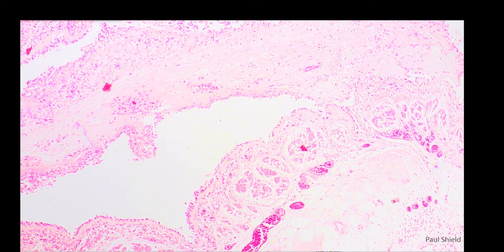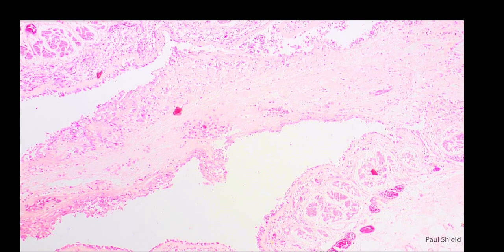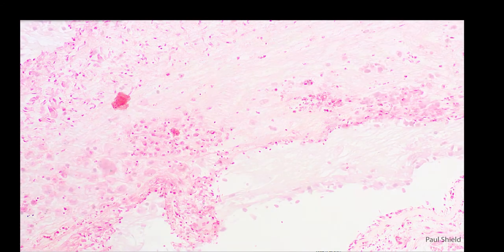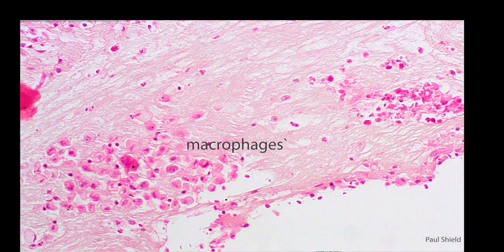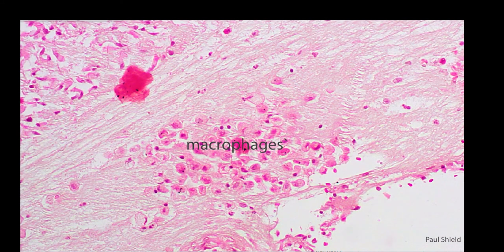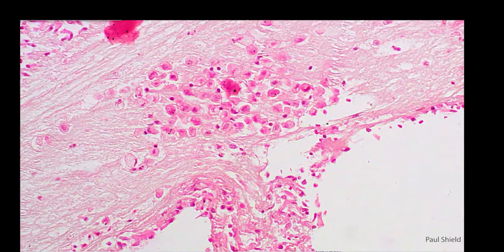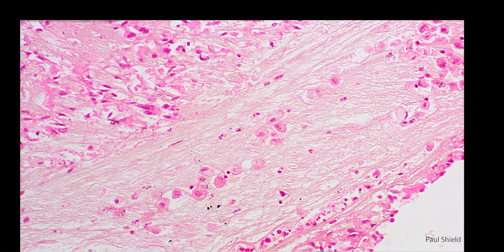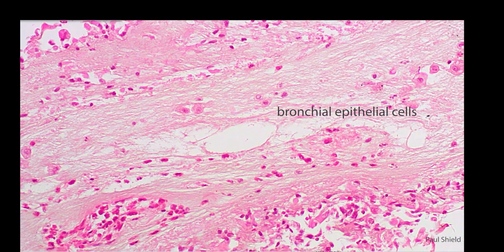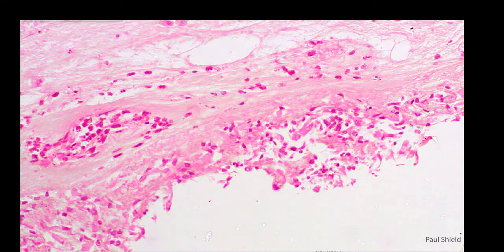This is the plug lying in the middle, and you can see it's fairly amorphous, a little bit fibrillary. It has cells inside it, so these ones are macrophages, pulmonary macrophages. They've got one nucleus and a fair amount of cytoplasm. Then the longer cells you can see now are columnar epithelial cells that have exfoliated off and are trapped in that mucus plug.